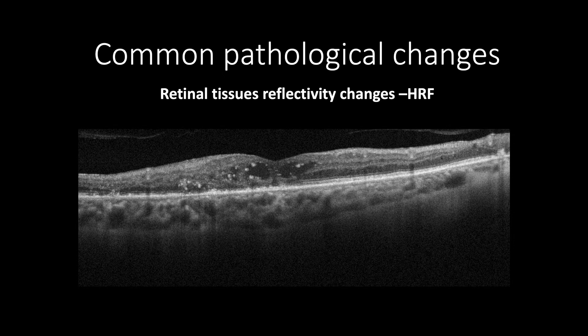This is another case of central diabetic macular edema showing increased central macular thickness with cystic changes. As we look closer, hyperreflective dots are surrounding the cysts, and those dots form what is called a pearl necklace sign, which may indicate chronic diffuse leakage due to chronic inflammatory processes caused by activated microglia.